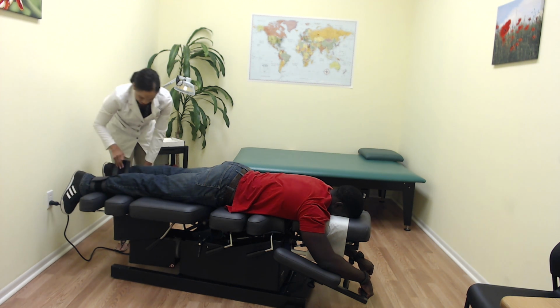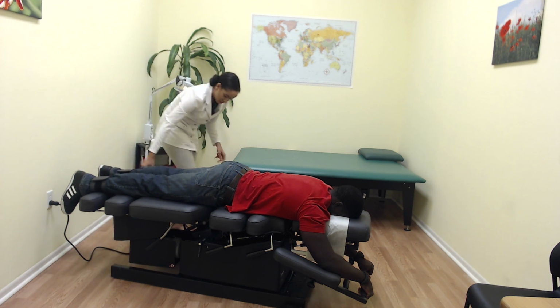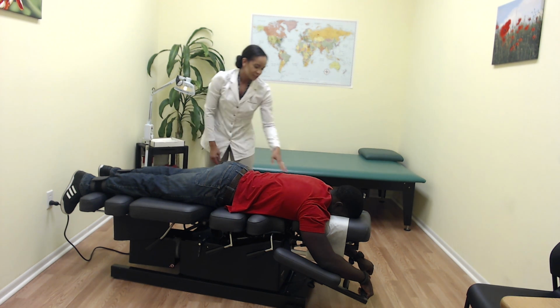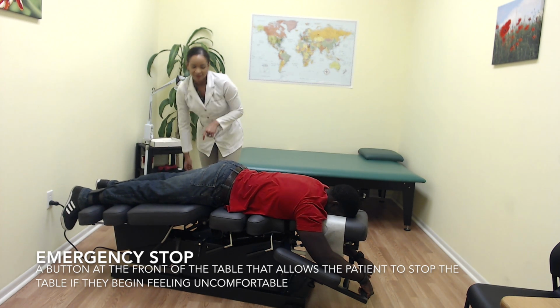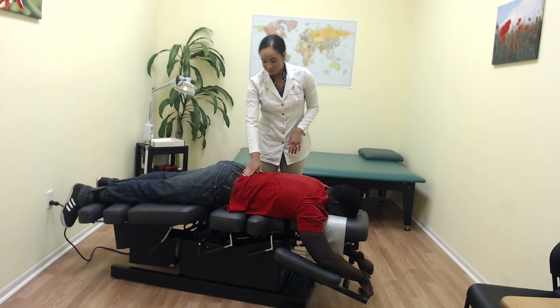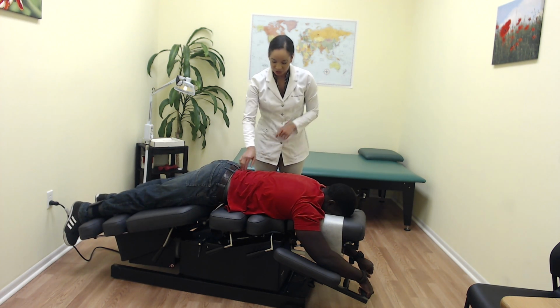So we're going to strap his ankles in at the end of the table. And then we're going to set the table to the speed that we want to do the procedure. Once I've got that set, I've already let him know where his emergency stop button is. We're ready to go. So we're going to go ahead and hit start. And you can see that motion is happening right there in his low back. It's really helping to flex again and stretch his spine.